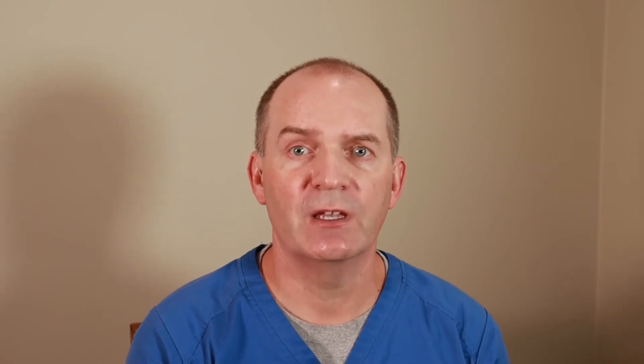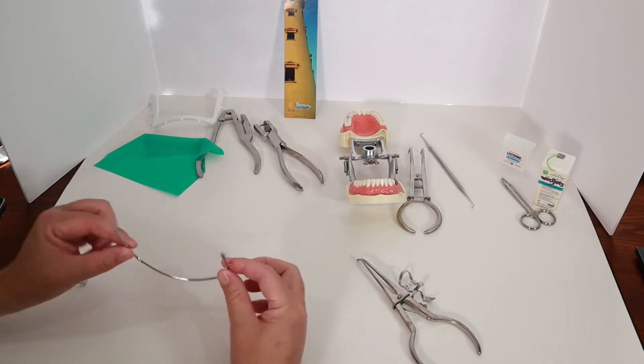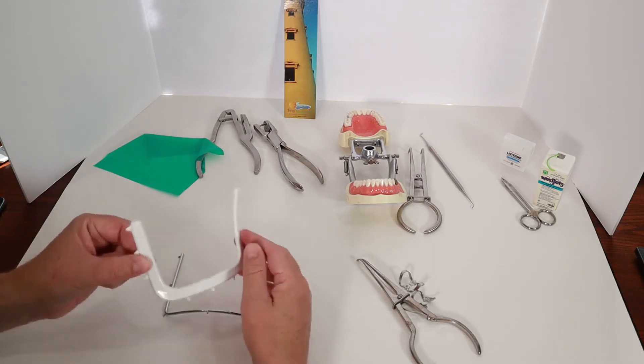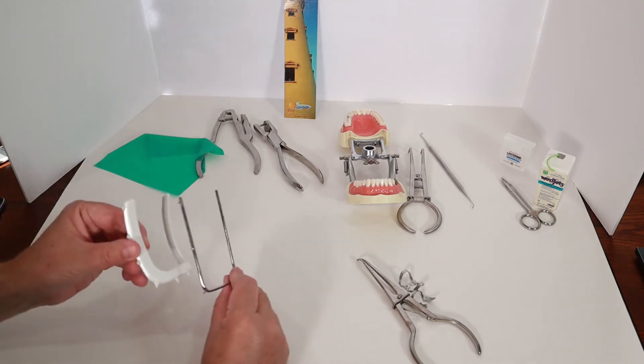The rubber dam then gets stretched around the clip. Once the rubber dam is on the tooth, the next tool I'll use is the rubber dam frame. It can be either made out of metal like this one or out of plastic like this one — both can be sterilized. This stretches out the rubber dam so that I can reach the tooth I'm going to be working on while keeping the tongue and cheek out of my way.